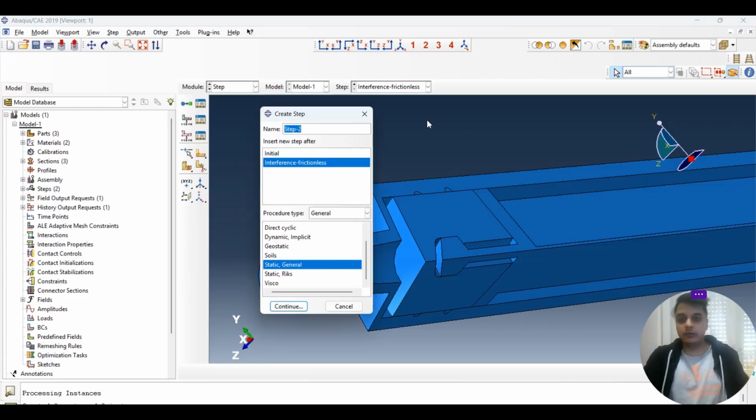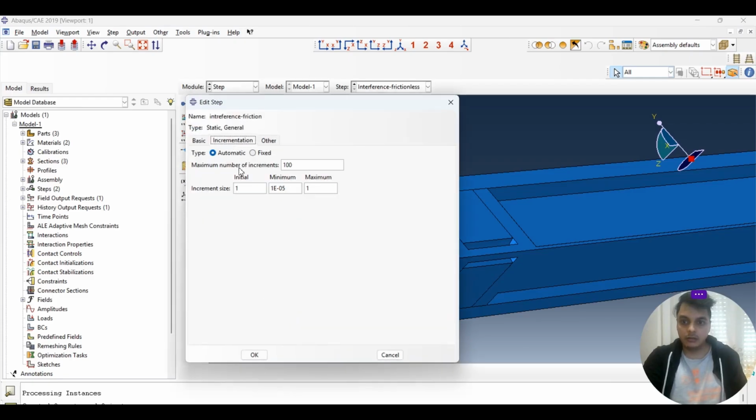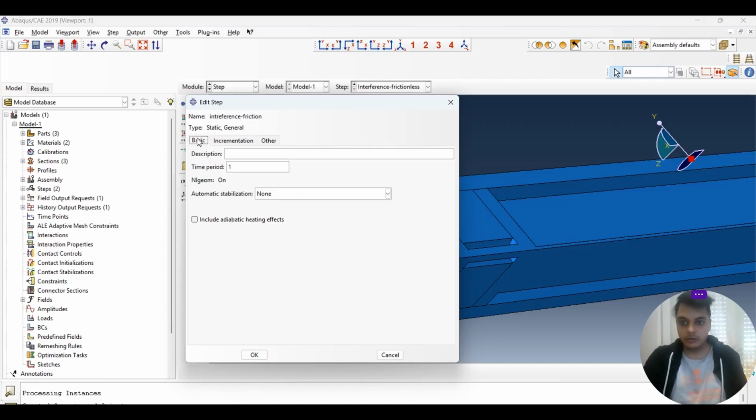Now we define another step. So we want the interference where we initiate the friction. So that's another step. And I just want it again 0.1, not a big issue.